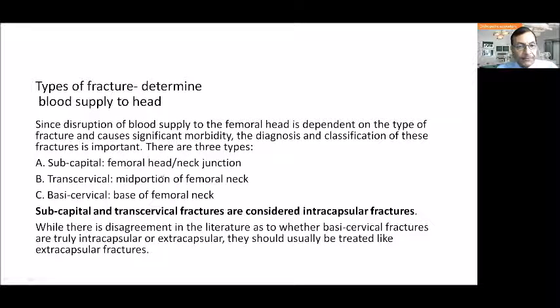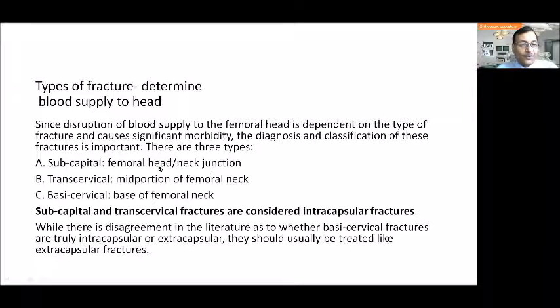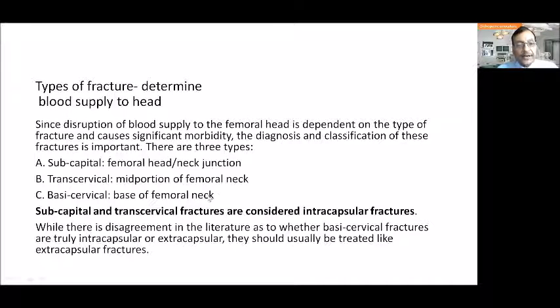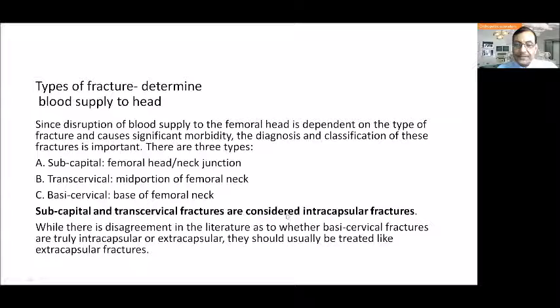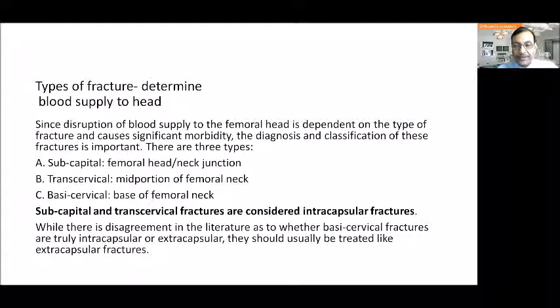There could be a subcapital fracture, very close to the head, or at the junction of head and neck. Transcervical means somewhere in the mid-portion of the femoral neck, and basicervical means the base of the femoral neck is fractured. Subcapital and transcervical fractures are truly intracapsular, while there is disagreement in literature as to whether basicervical fractures are intracapsular or extracapsular and whether they should be treated like trochanteric fractures.